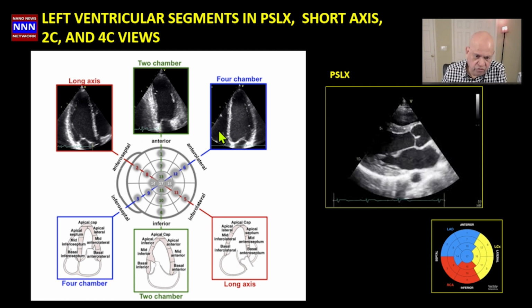So these are two main things that we need to memorize, because these apply mostly to echocardiography. In nuclear, not much emphasis is placed on regional wall motion abnormalities, and similarly, with CT or MRA, we are focused more on evidence of reversible ischemia, scar, or infiltration.